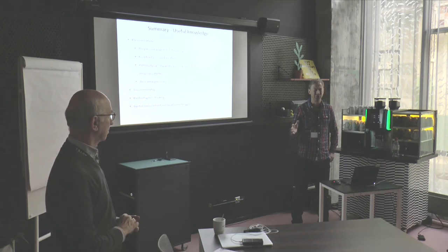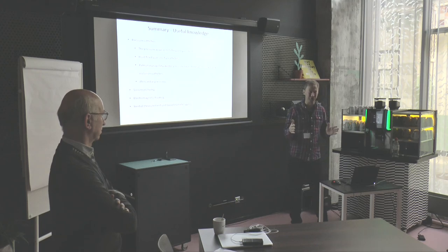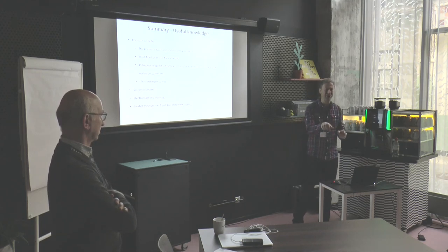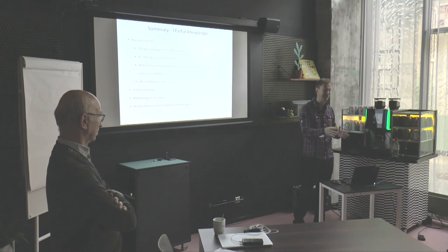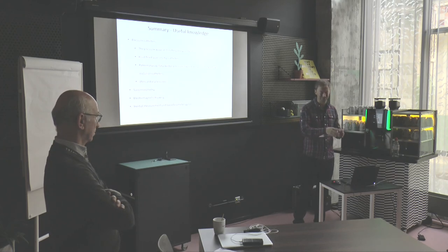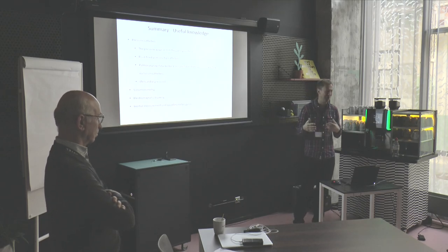Yes, I didn't go through that, but the calibration procedure is something also. There are ways of doing it. The boxes come with 0 and 100. I don't trust those. So I put them into a certain apparatus where we have a machine that generates the pressure, and you sample that, no pressure, then you take another pressure and then a higher pressure and you sample that. So you have two pressures and two nulls. So that's the gold standard of calibrating.